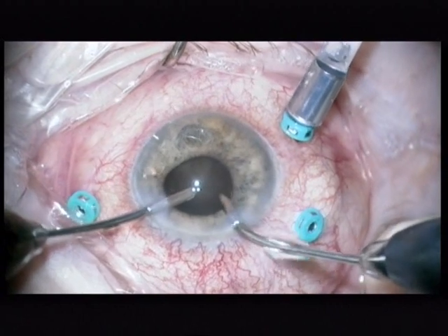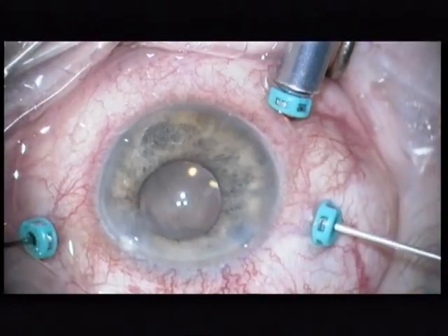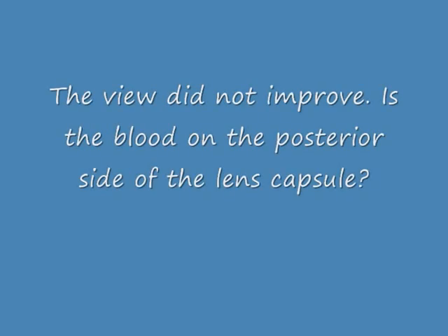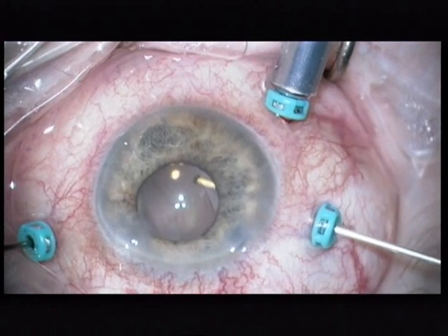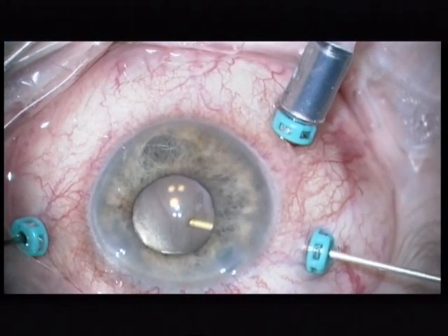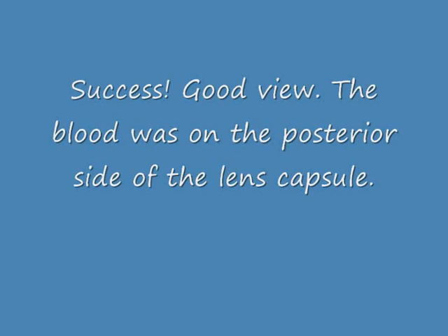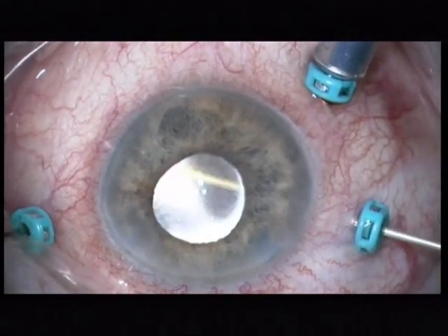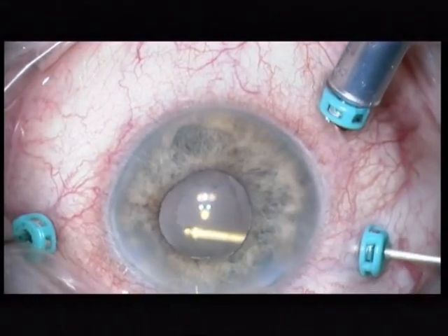But I cannot find blood here. There is still a staining there. It must be staining on the posterior part of the lens capsule, due to the severe hemorrhage. So, I am opening now the posterior lens capsule, and now the view — the vitreous cutter — is good. There was a strong staining with blood on the posterior side of the lens capsule.